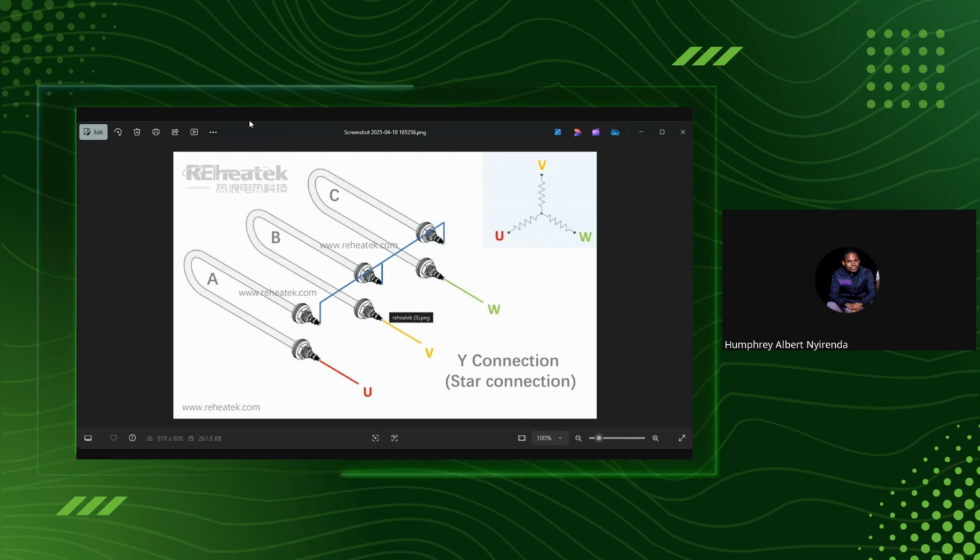In that case you have achieved feeding each element with two phases. The difference is that delta is meant for systems requiring high power, where sterilization temperature and pressure are high, while star usually requires low power, where sterilization temperature and pressure are minimal. That's the difference I may elaborate.